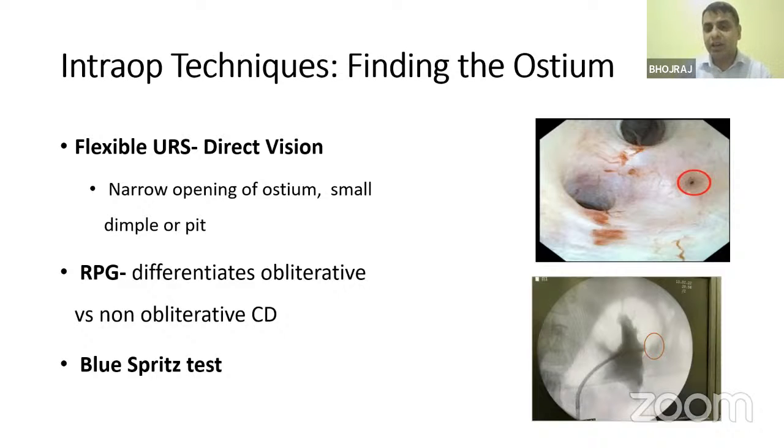And if you could not find the ostium at all, then the blue dye test is one of the options.